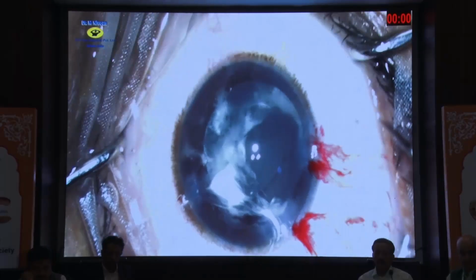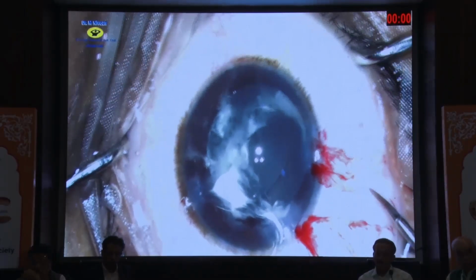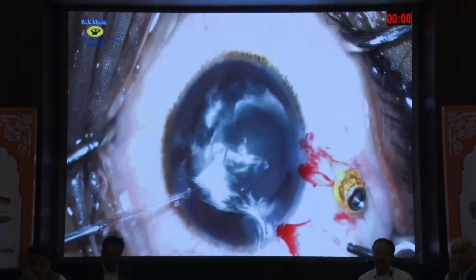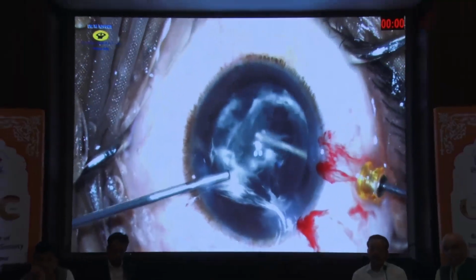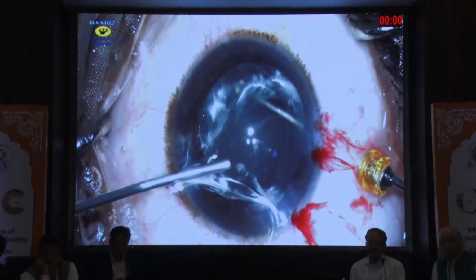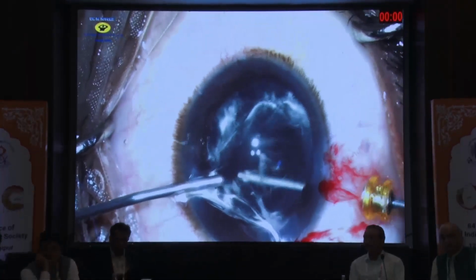Because you will not be able to remove the cortex. So here again, this is why the pars plana approach: you can use the trocar, and keep the irrigation in the anterior chamber and use the posterior port only for cutting the vitreous, as you can see here. You can use the regular phaco machine for this vitrectomy, or?